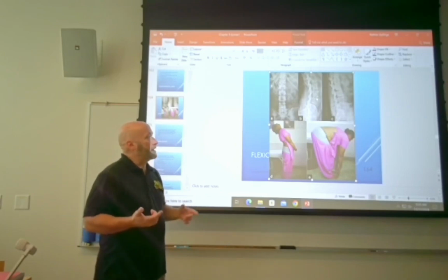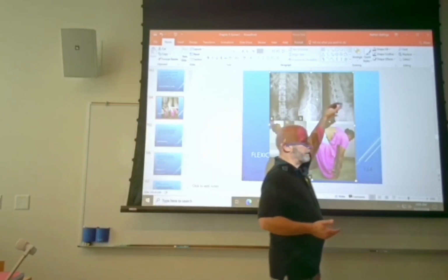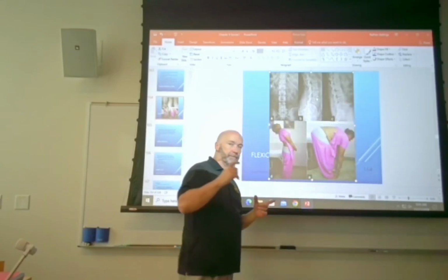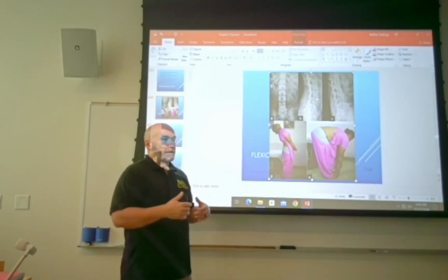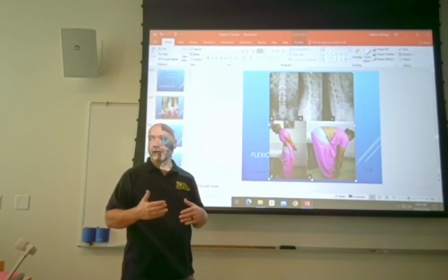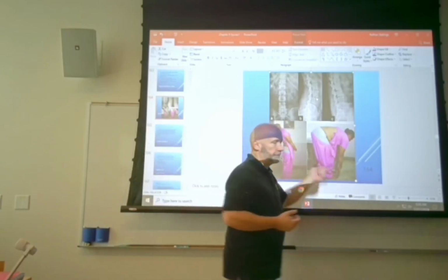What they're looking for in those cases, if they're not looking for actual mobility, is how well is that fusion taking place? Are the bones growing together? Is the bone plug growing to the vertebra above and below? Or when they flex and extend, can we still see a gap in between the two, indicating that you've got non-fusion of those bones? Okay, so that's one reason we would do flexion and extension.